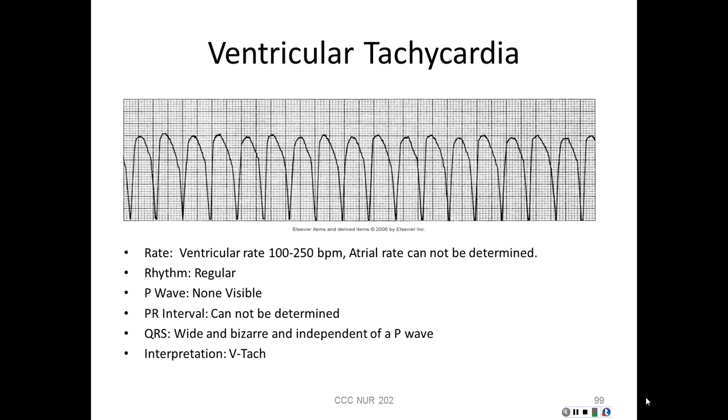This is a life-threatening dysrhythmia. So if you see this on the screen, you must go assess your patient. Patients can have a pulse with this. And the treatment's going to be based on whether the patient has a pulse and what their stability is as far as the cardiac goes, their blood pressure, and their level of consciousness.